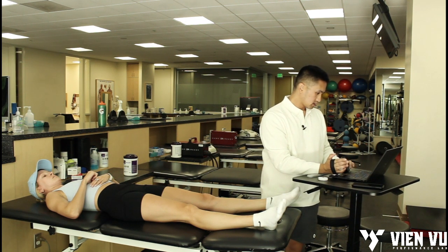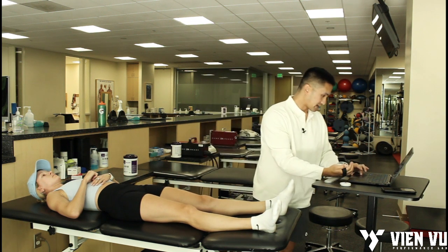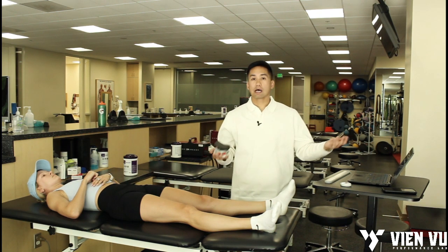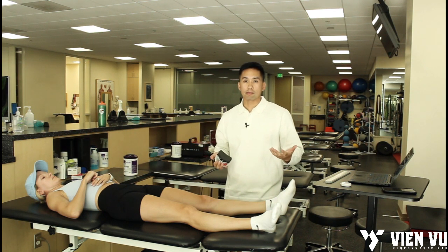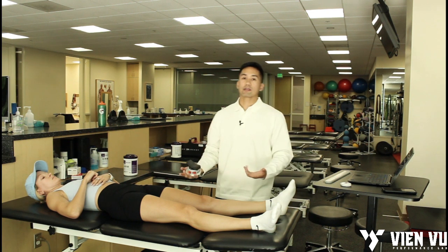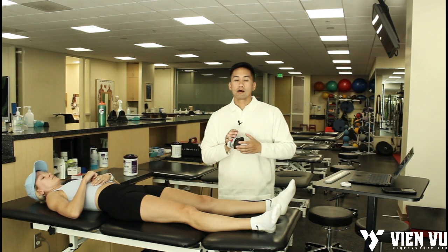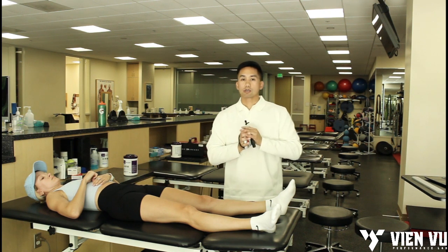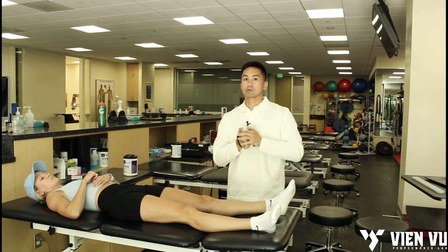With the calculations it tells me the percentage difference side to side — I'll go over that with the athlete. That's how I would go through hip strength testing with a handheld dynamometer, specifically the micro-FET or any other standalone dynamometer. It's not dictated by how much I want the athlete to move versus what an app tells me. If you have any questions, ask them in the comment section. Check the description — I have my calculation sheet there and other resources on dynamometry and force plates. Look out for my upcoming courses around the US coming to different states soon. Hope to see you there!